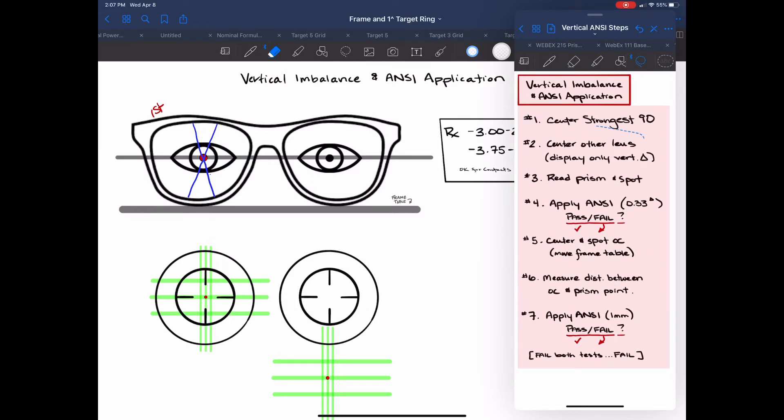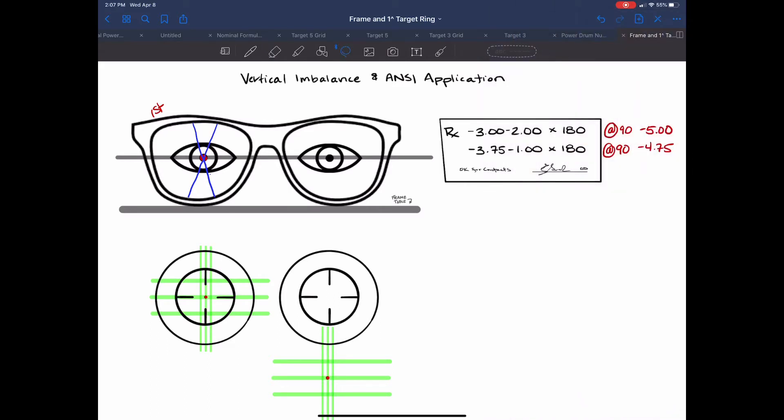Now we're going to center the other lens and display only a vertical prism. So now we're going to move over to this other lens and one thing we cannot do is move this frame table. So the thing that we're going to expect for vertical imbalance is that when we reposition the lens we are allowed to move it right or left but we're not allowed to move the frame table which is what's going to allow us to move the lens up or down. So if we can't move that frame table all we can do is move the lens right to left. We're going to get it so that all the prism is in the vertical meridian in the 90 and then set it right there.